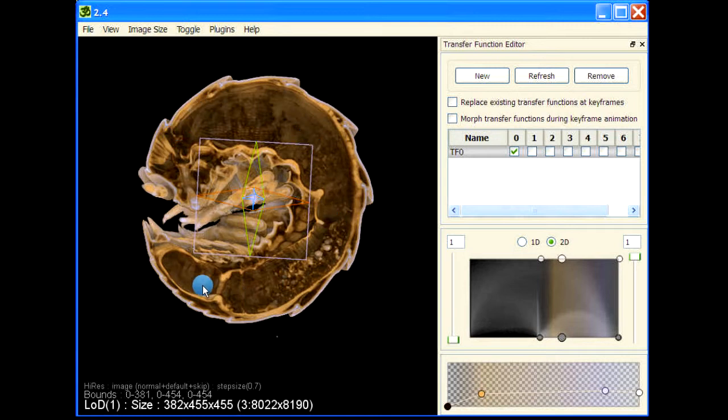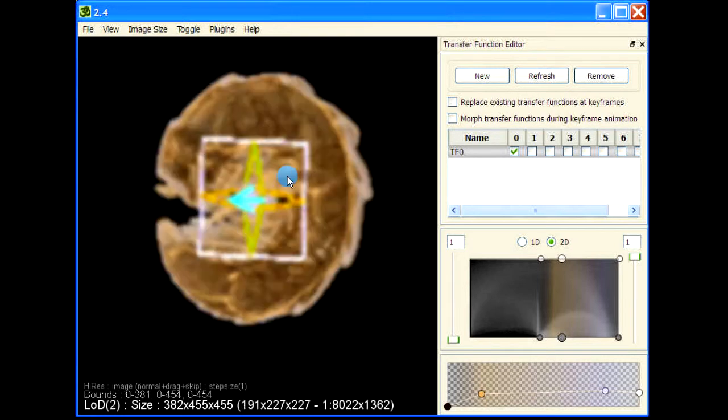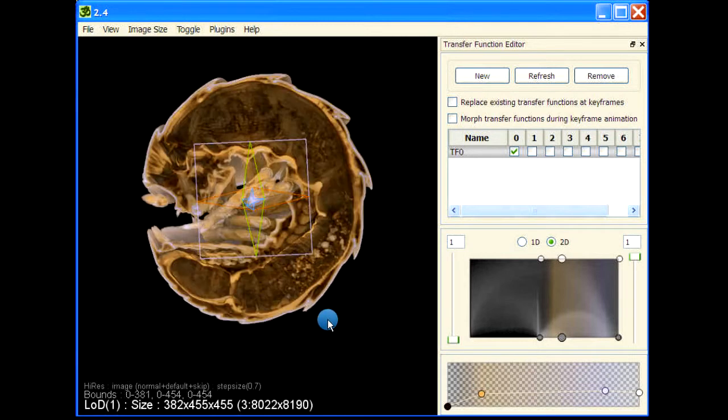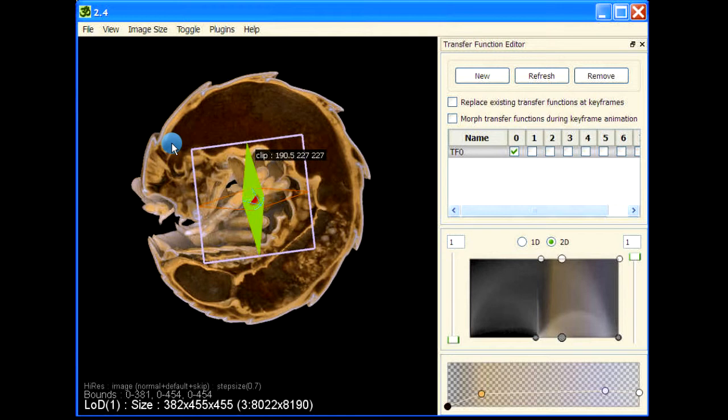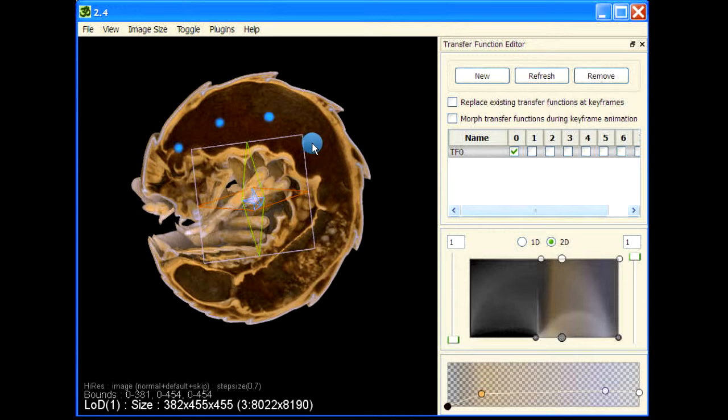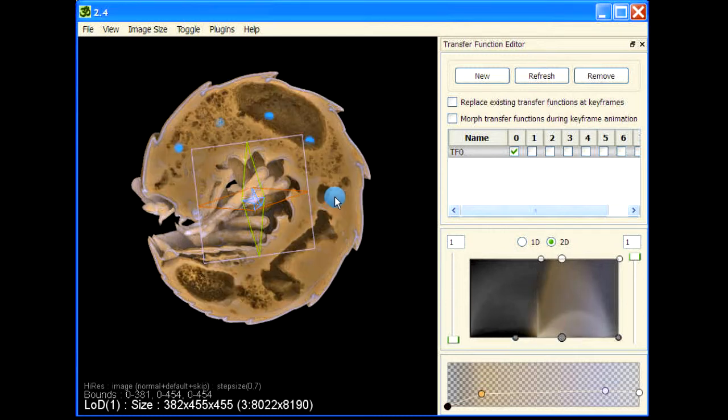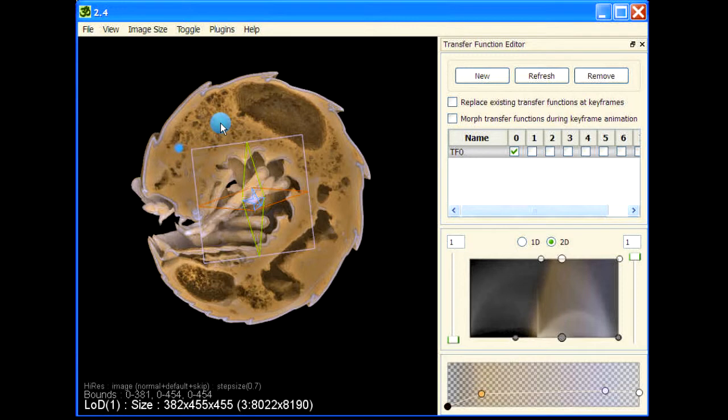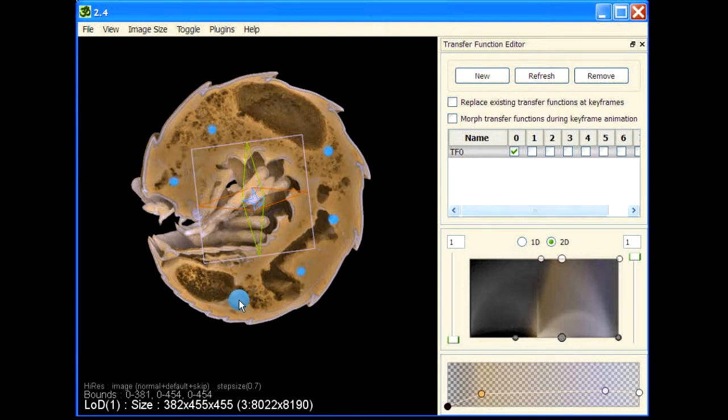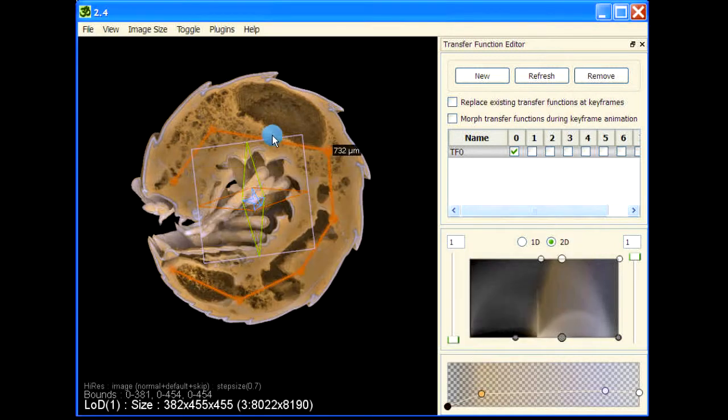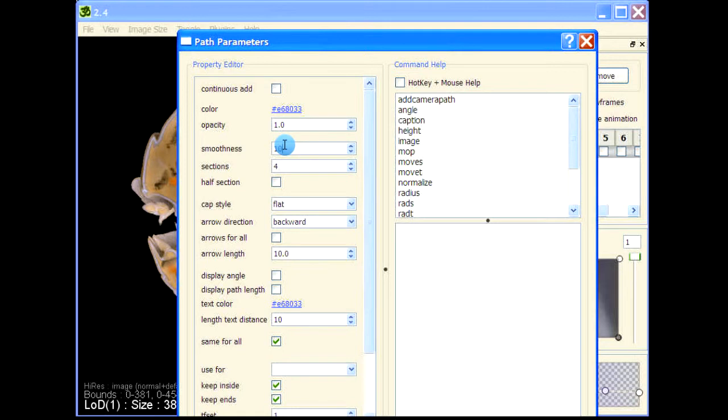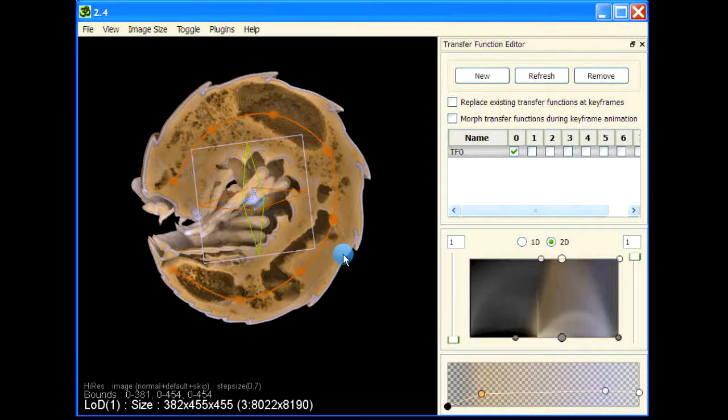We can see the insides of the isopod and we can extract this interior feature of this data and then straighten it out using path. Let's use the path and add some points here. Remove those points that are inside. I would like to have the points in the plane, so point here, another point here, and another point here. Let's put a path.